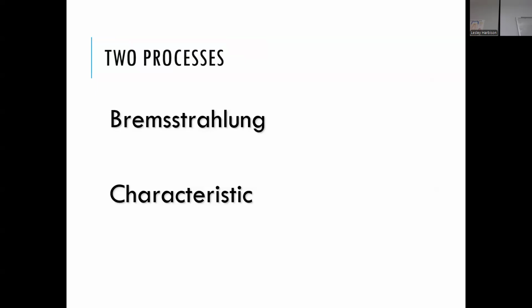So I probably should have had that slide here before I talk about it. That's a mental note for next year, but we'll get to what makes them weaker and stronger in a minute. But Bremsstrahlung and characteristic are just basically two different ways that X-rays can be generated. One is very consistent, and it generates a consistent, similar strength X-ray. The other one is a little bit more willy-nilly, and some of them might be weak, some of them might be strong. It's a little bit more inconsistent.